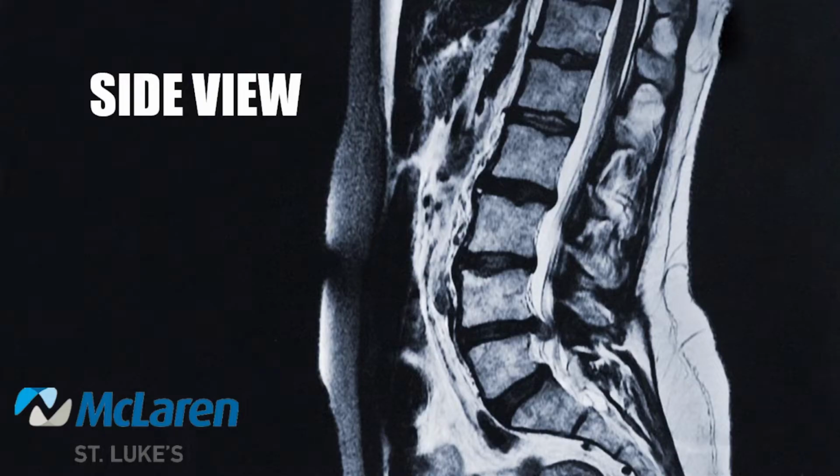This is an MRI of the lower back. We're looking in from a side view, so to get you oriented, this would be the front of the abdomen, this would be the outside of the back, this here would be the tailbone. The bones are numbered, so this would be the 5th lumbar vertebra, the 4th lumbar vertebra, the 3rd, 2nd, and 1st lumbar vertebra. In between the bones are these dark oval spaces, which are the disc.